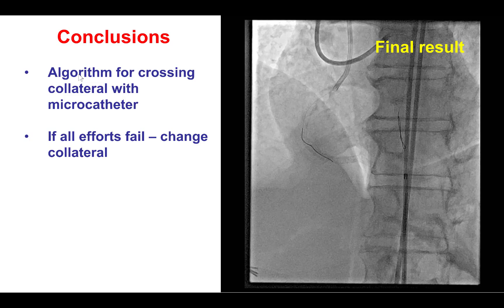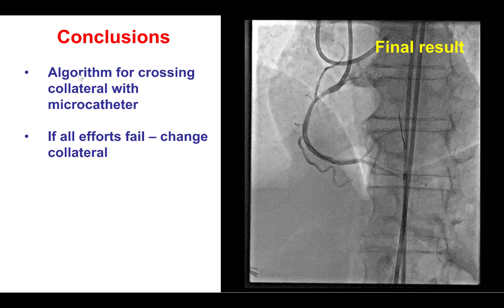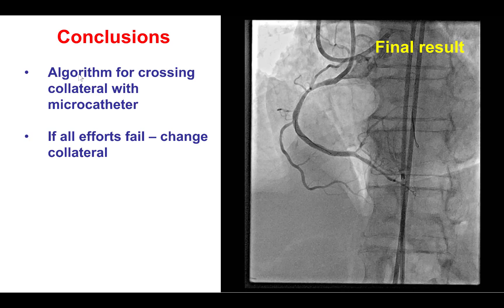But if all these efforts fail, one option is to try to cross with the retrograde wire into the proximal true lumen if the occlusion is very short — which was not feasible in this case — or otherwise try a different collateral that will allow crossing with a microcatheter, as was done in this case.